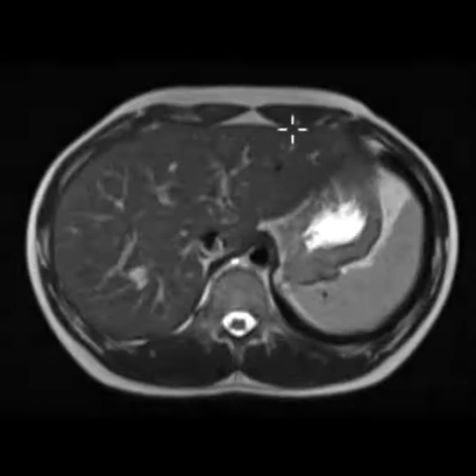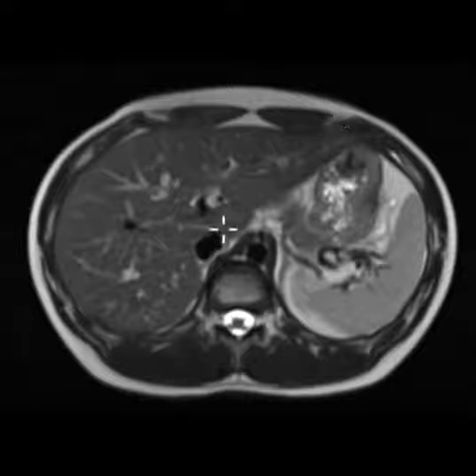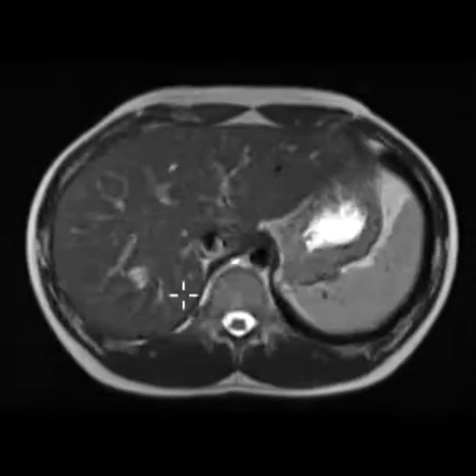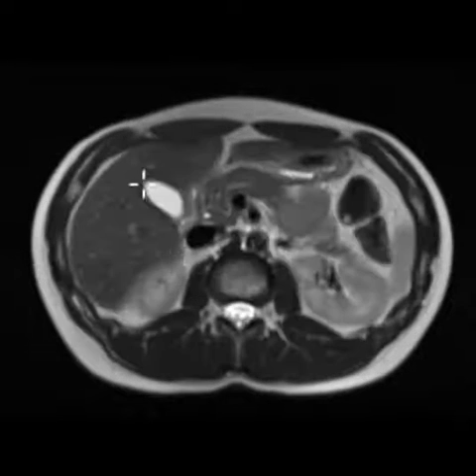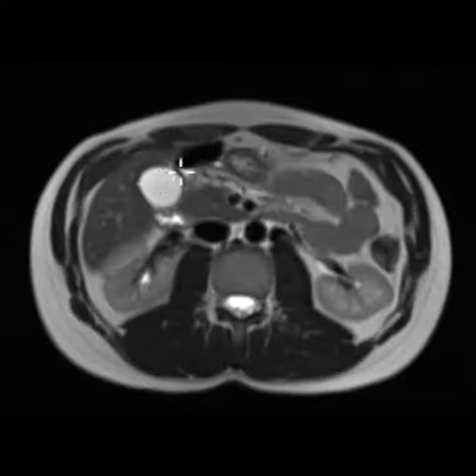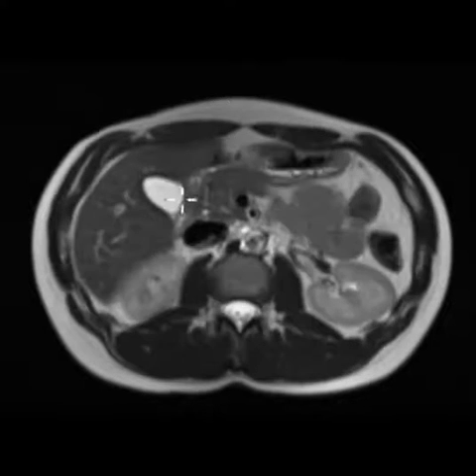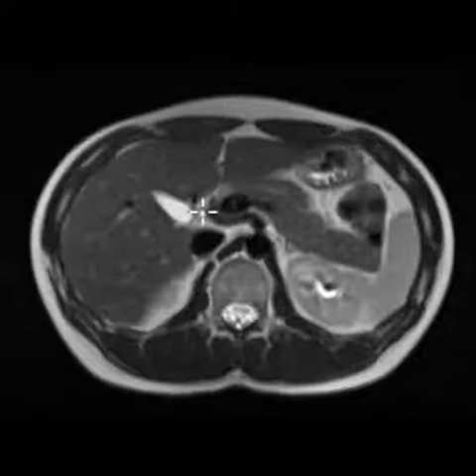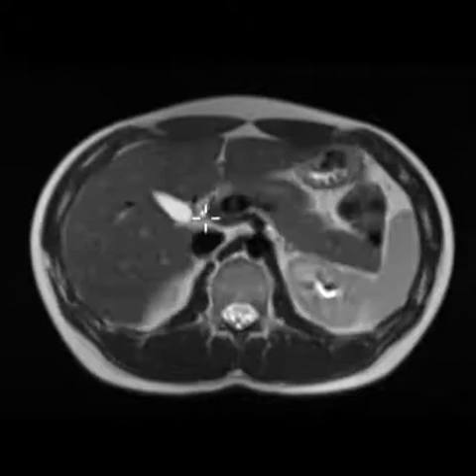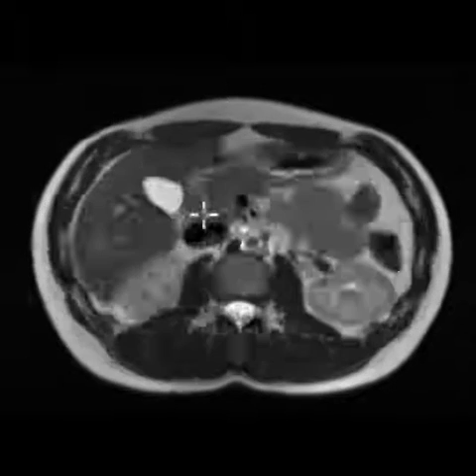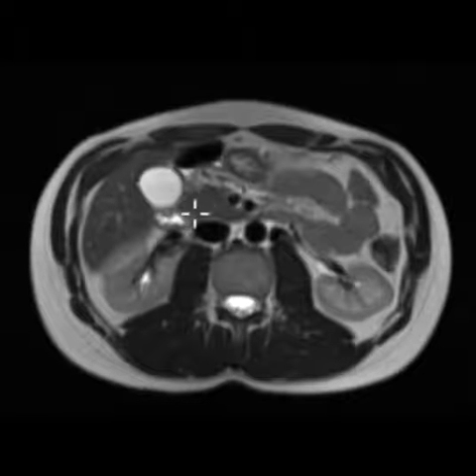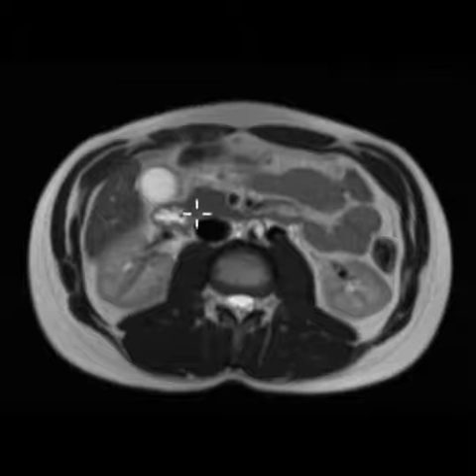The liver has the left lobe over here and the right lobe over here — two lobes. If we go down below, we see the gallbladder filled with bright bile. This is pretty well distended; there's no wall thickening and we don't see any gallstones. Coming out we see a little structure here — this little dot — this is the common bile duct, which will come down and drain into the small intestine.